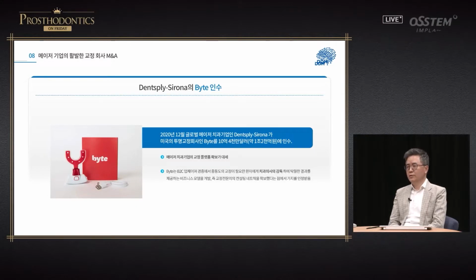I thought the value was going to drop because of B2C without case selection. In acquiring data, it requires expert touch. If the patient takes impression and an appliance is made out of it, then there's an issue of data gathering. Case selection is going to be a problem, and there's going to be many problems associated with it.